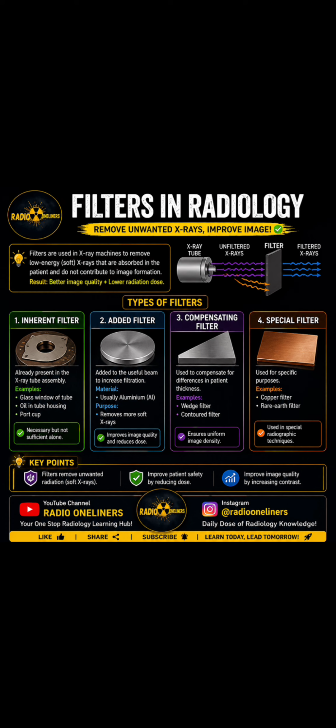So what are compensating filters? They are used to compensate for variations, but where? In patient thickness, because we know that each patient has its own thickness. Some are thin, some are thick, some are medium. So these filters are just going to compensate for those variations.